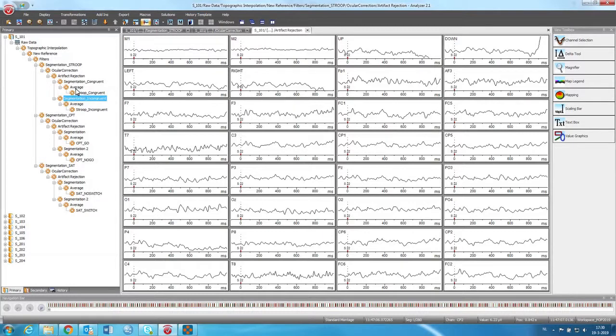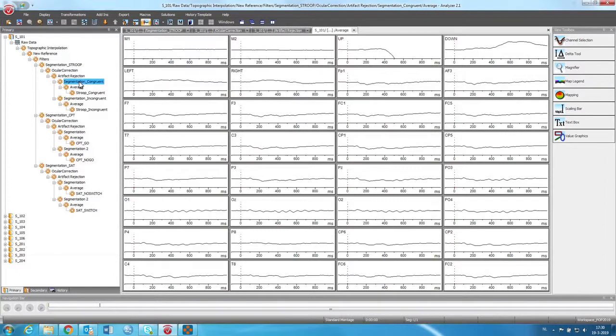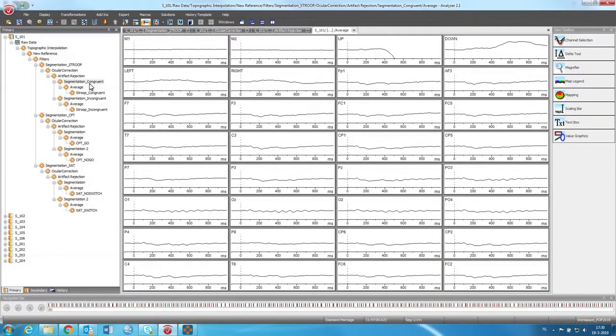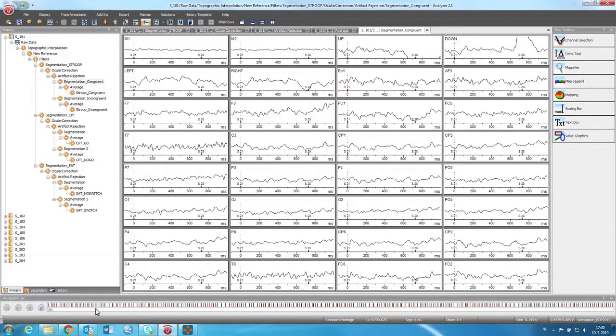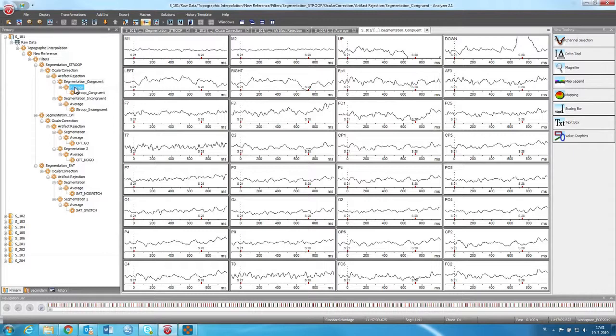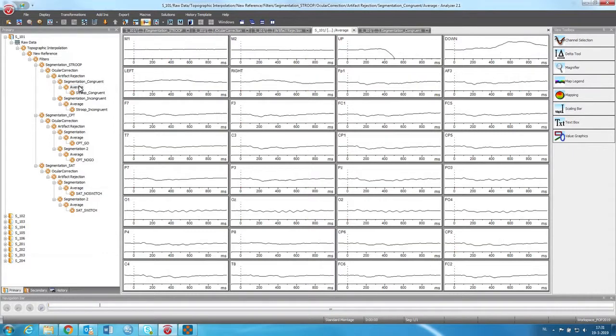And what we do then is averaging. So we have a lot, as you can see here, we have a lot of trials. We have 280 left. So what we want to do is average all these 280 trials into an average. So that's this computation.